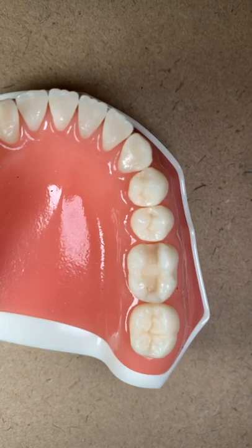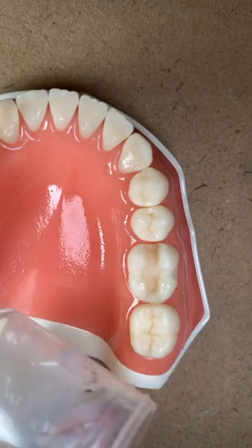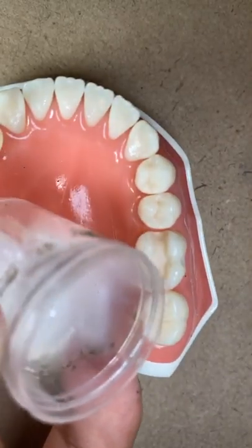For the molar, I will do the bigger hole, the biggest one, and for the premolar, I will do the middle hole. Okay. And then don't forget to use the lubricant here. Yeah, I have lubricant here.